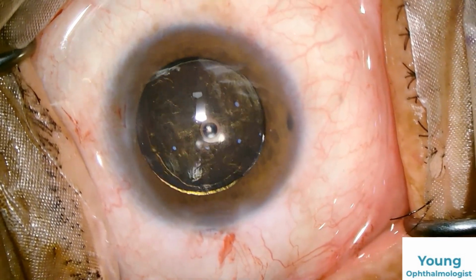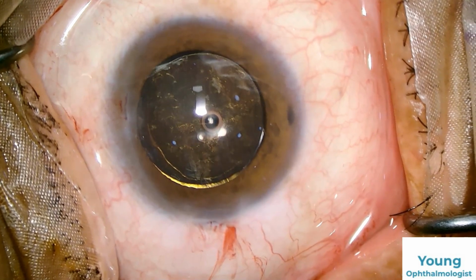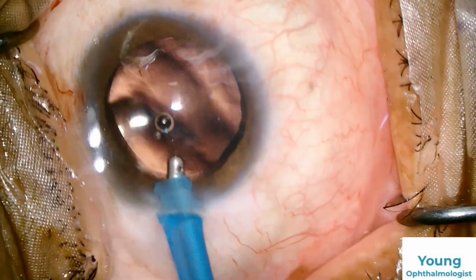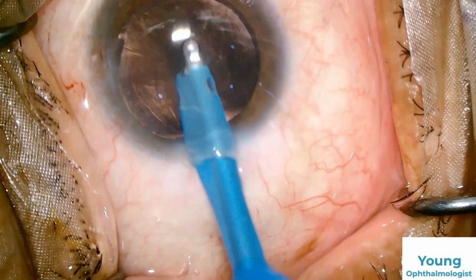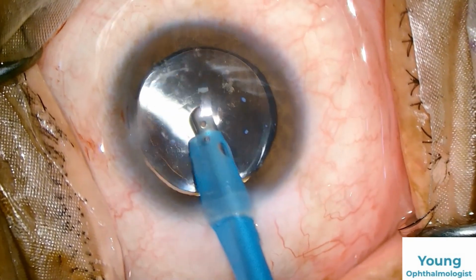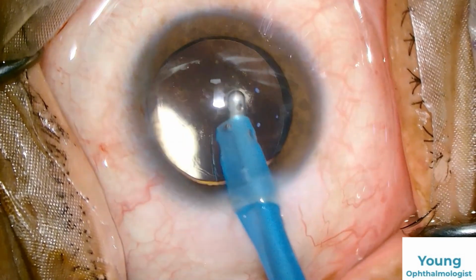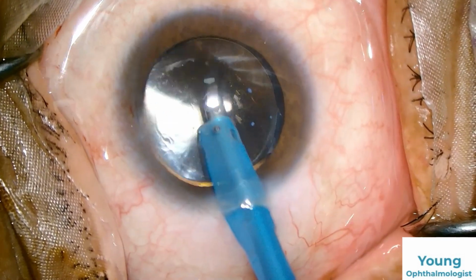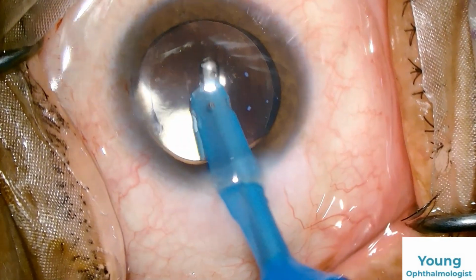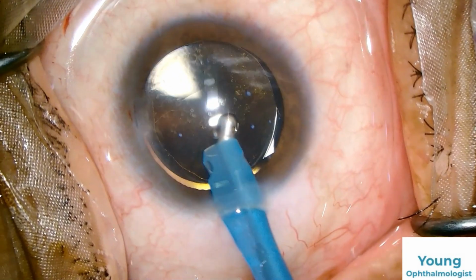Here, we can use advanced monofocal lenses if the patient's pocket allows, but trifocal and EDOF lenses are not advised as patients have retinal problems, multiple intravitreal injections are given, and previous CMO was there. So the best solution for the patient here is putting a good hydrophobic monofocal lens, or if they want, you can use an advanced monofocal lens.